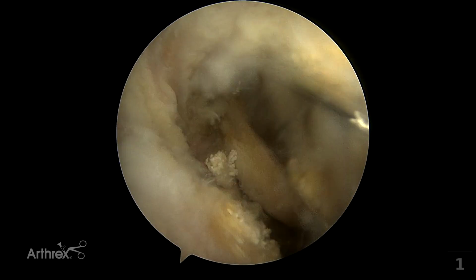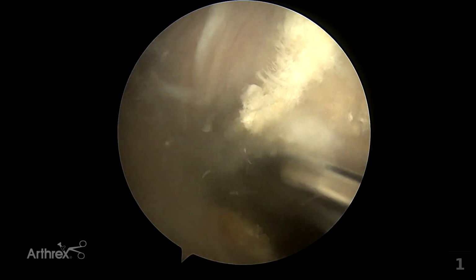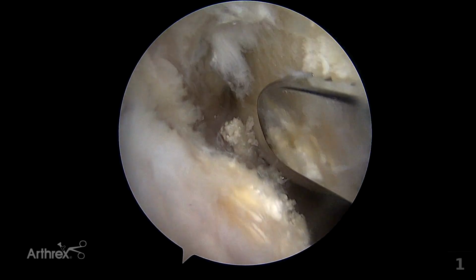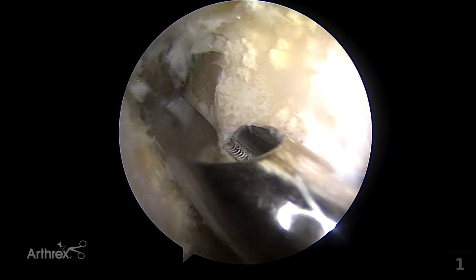So you can see we've really resected a significant amount of bone, easier to see back here, and you're starting to be able to see the posterior horn. We can go right up to the PM bundle of the PCL. So here you can see the nice effect we have now. We've safely opened up this medial wall. Now we'll work on the eminence.